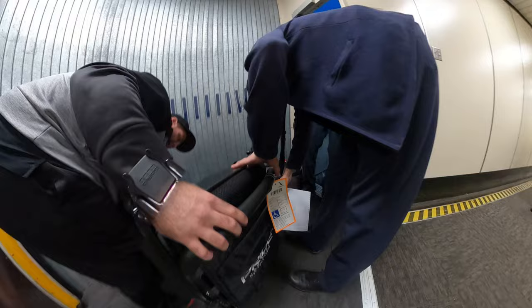At this point, we're just securing the unit so that the power wheelchair can safely travel on our trip back home to Fort Lauderdale.